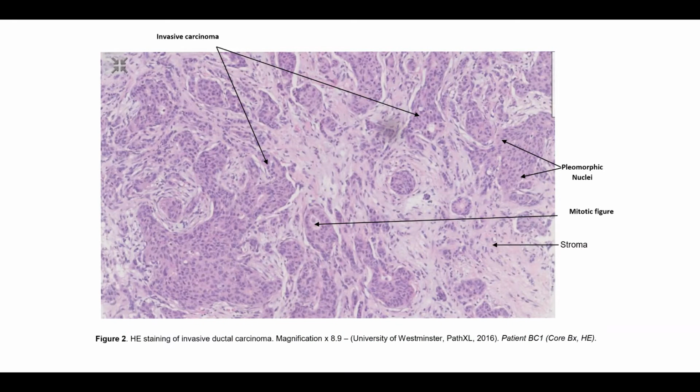This is a H&E stain of the histopathology of the breast in the patient. We can see that the nuclei have stained purple, which allows us to see various pleomorphic nuclei and epithelial cells. The epithelial cells are interspersed within the stromal tissue, confirming carcinoma invasion. There is no differentiation between myoepithelium and epithelium cells.